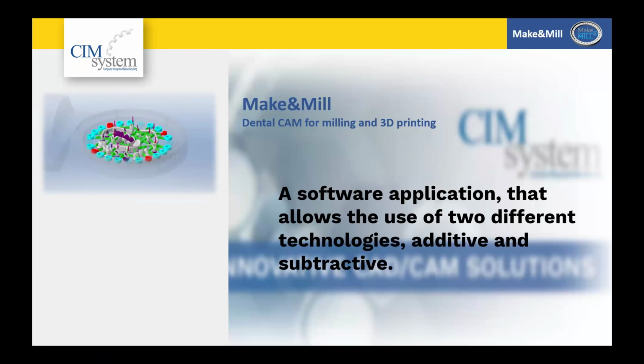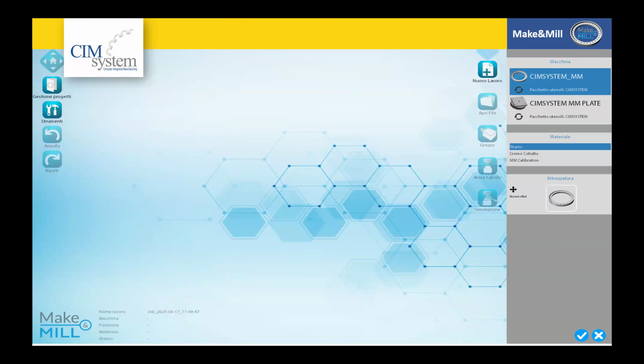So okay, Make&Mill guides dental operators through the nesting process on the sintering machine and produces toolpaths for refining printed restorations on the mill. Once the object has been created with additive technology, the Make&Mill solution allows the object to be milled automatically, identifying only the parts that need to be finished, resulting in reduced tool usage and shorter execution times.